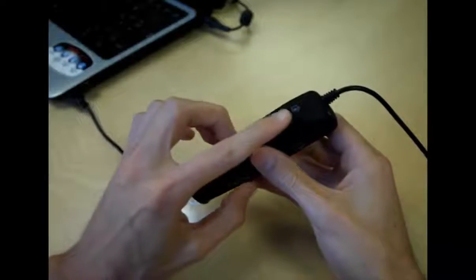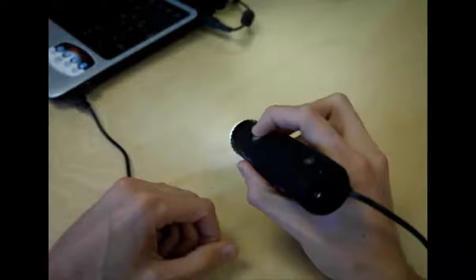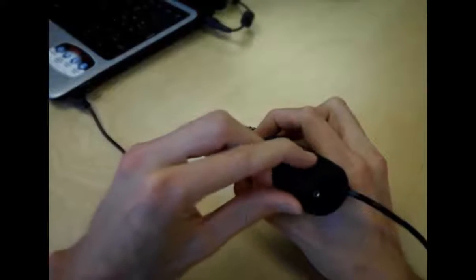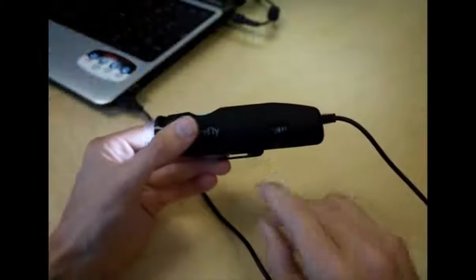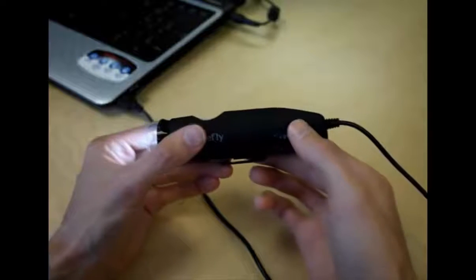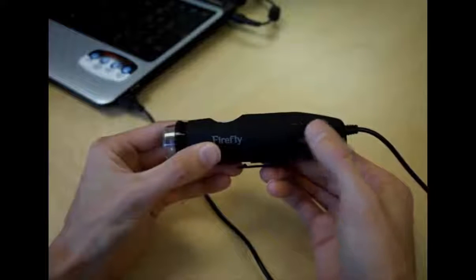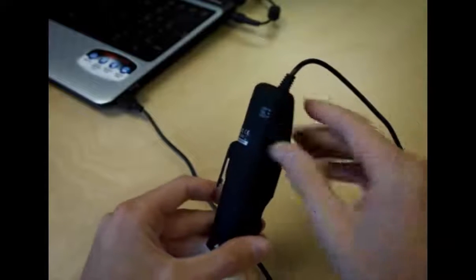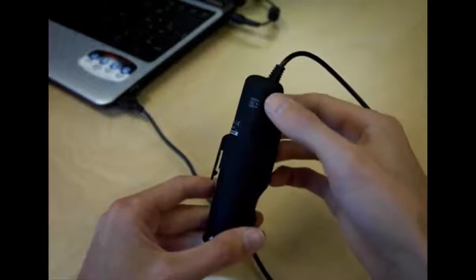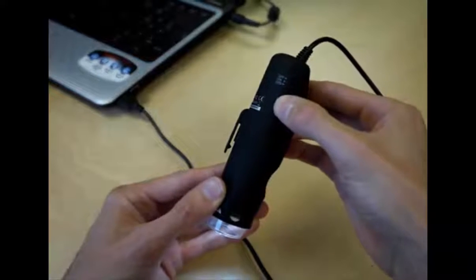Next, this is the snapshot button. You can click this when viewing the live image if you want to scan a picture during one of your studies. This here is the brightness dial. You can turn it up or down, but I recommend keeping it fully illuminated all the way up. This is the power switch here. We went over this earlier. To turn it fully on, switch it to LED.